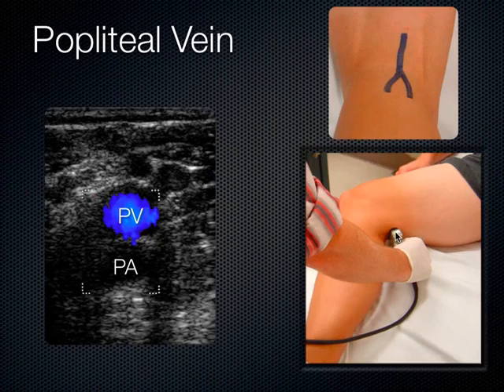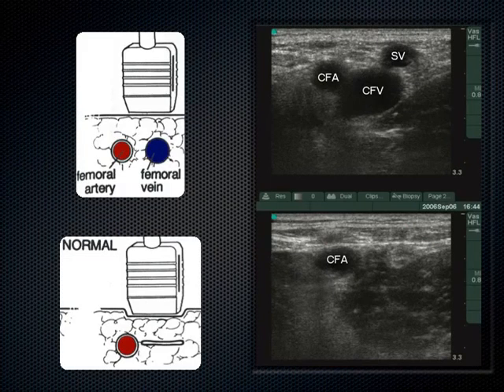Now, when you do the scan, what I do is I hold the probe in one hand, and then I put my other hand on the patient's knee, and I use that as sort of counterbalance or countertraction to push those two things together. Now, on our models here today, you may forget to do that. Their legs are pretty small, but on the range of body habitus that we encounter clinically in the emergency department, you're going to really want to kind of get in there and use both your hands counterbalancing each other. And so try to remember to do that today when you're practicing this test.